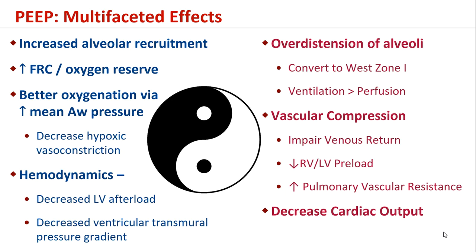Yes. Alveoli and capillaries, it's like a bunch of grapes with a capillary network around it. Over-distension of the alveoli will constrict or press the capillaries. So effectively there is a VQ mismatch. Ventilation is increasing, but the perfusion has been paradoxically reduced because of over-distension of the alveoli. So you do see that the patient's saturation sometimes starts to fall once you start giving high amounts of pressure, and once you disconnect from the ventilator, suddenly the saturation improves, the blood pressure also improves. So this is a zone 1 phenomenon.